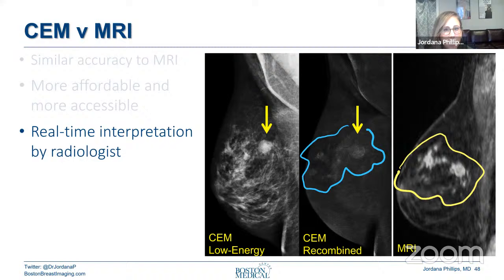The number of times that I've done these exams and have shown the patients the images, when they're totally negative, in a patient who has dense breast tissue, is really comforting to these women to know that they can believe these results. Or similarly, in a patient where the contrast mammo is done for staging, I can say, don't worry, this area is isolated to this one small thing. You're good. The rest of your breasts are just fine. So this imaging modality allows us to maintain that communication with our patients, especially in this time where I think that communication and connection is important.